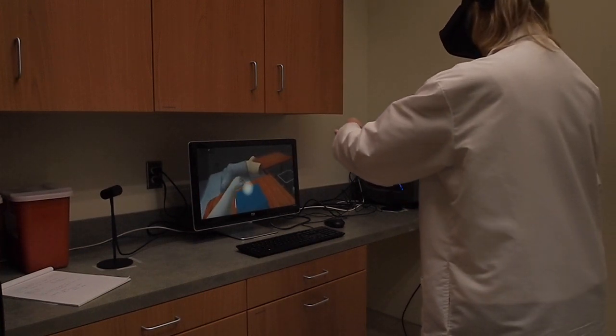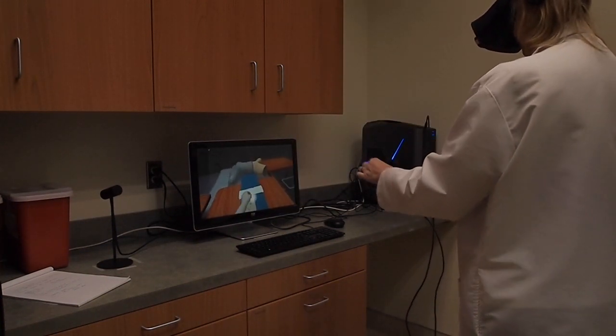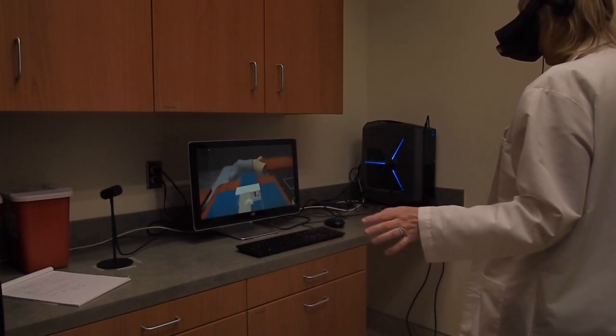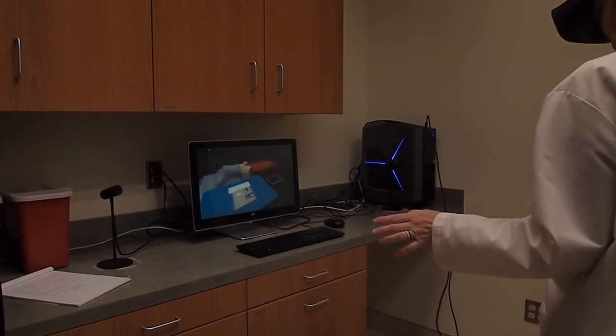First, look at your palms so the tracking system recognizes them. Then reach out for the glowing tab and unwrap the package back, left, right, and forward.